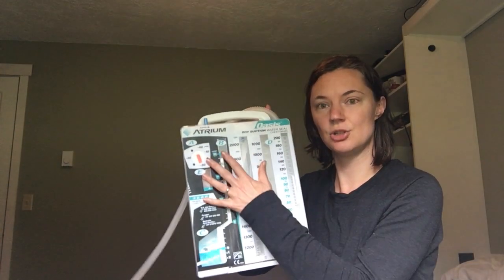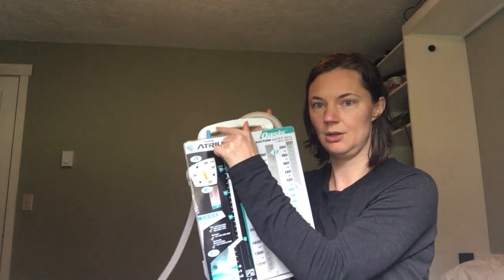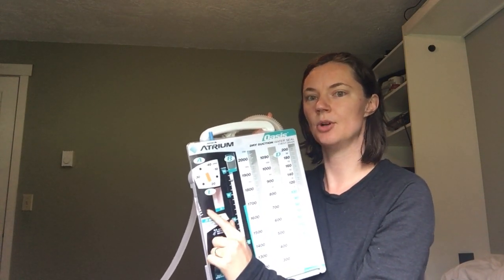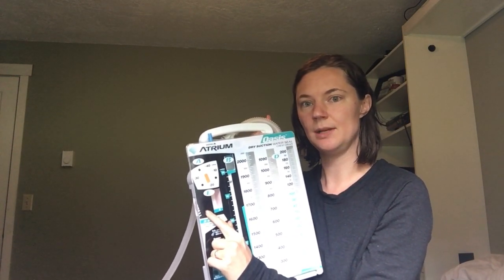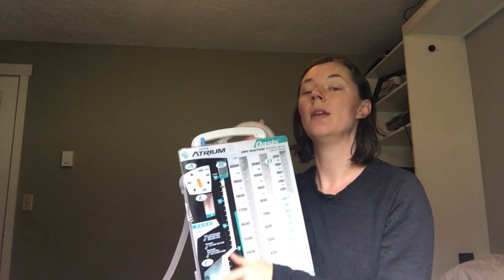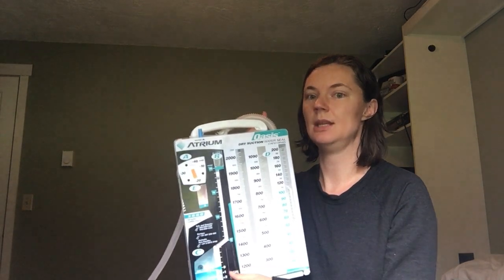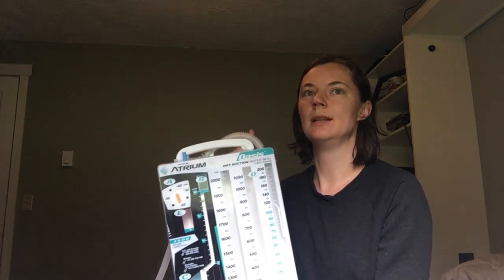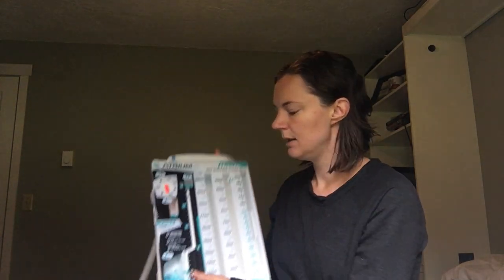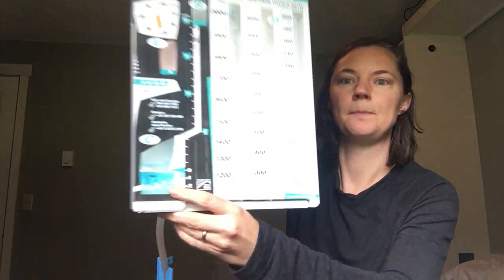When you're assessing your tube, make sure that it is where the order says it should be, that suction is plugged in or not plugged in, that the accordion bellows are out if your patient is on suction, and that if it's the Ocean, which we rarely see, it will have fluid at the right level and it's bubbling to a gentle bubble if it's to suction. This is the air leak chamber down here.